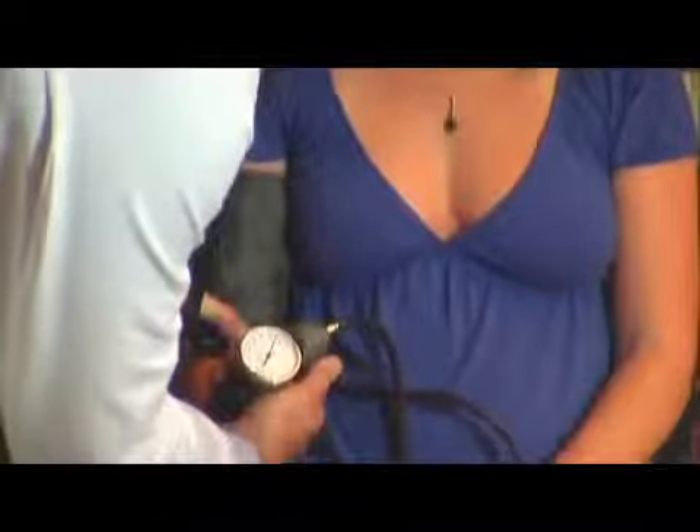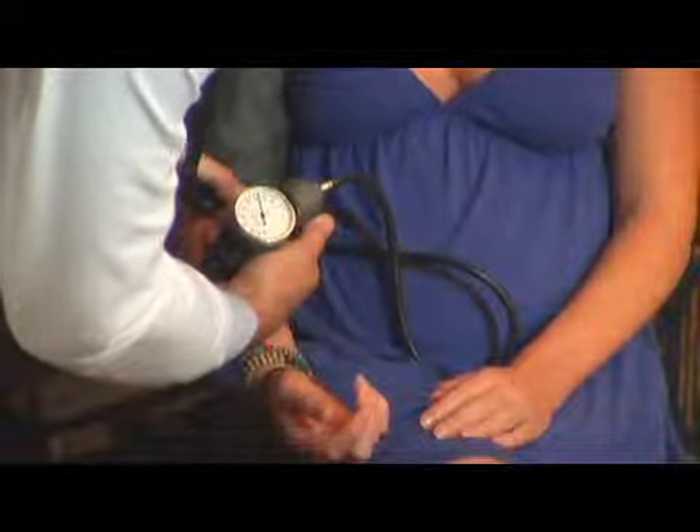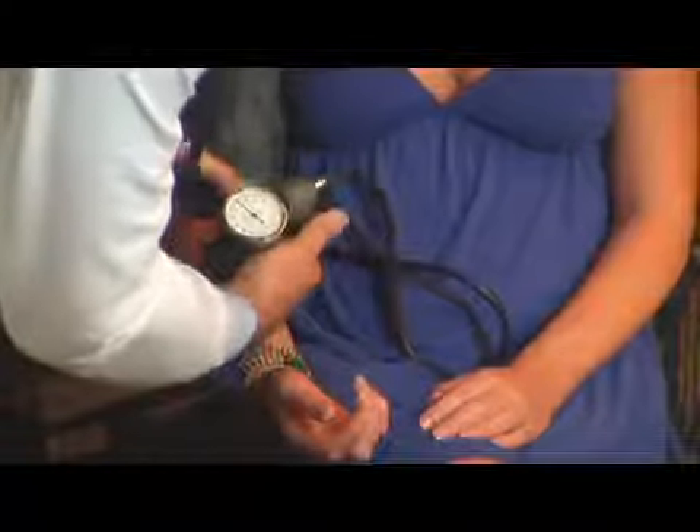Then you slowly release the air pressure while listening to the blood flow in an artery in the arm. The measures you get are: when the blood flow starts, which is the systolic or high part of the blood pressure; and then the diastolic reading, which is the low part — that's when the blood pressure cuff has completely let go of pressure on the vessel, giving you the baseline pressure of the blood in the vessel itself.